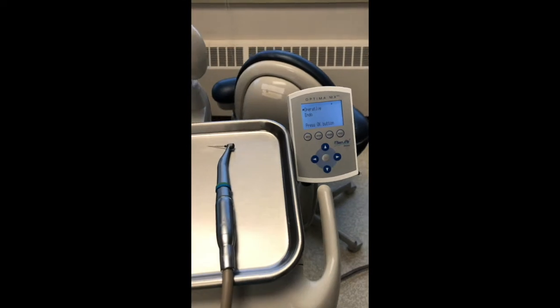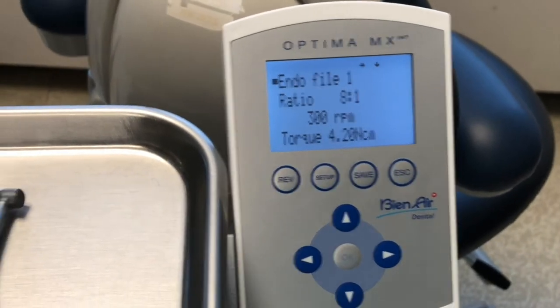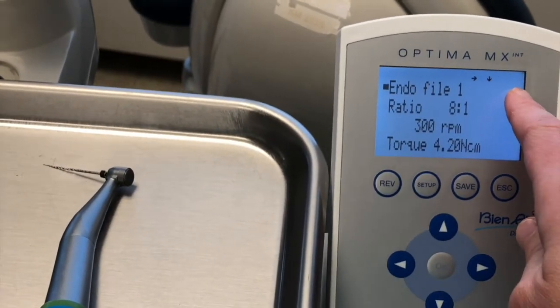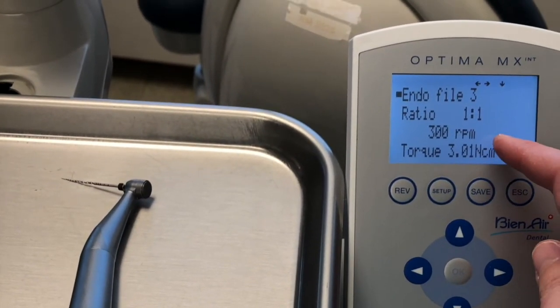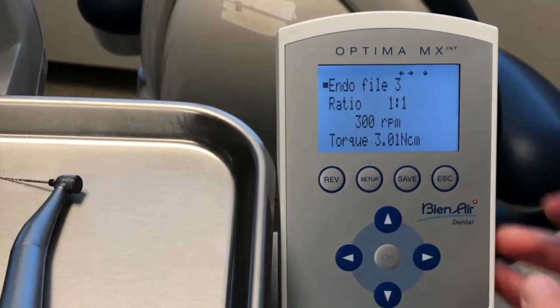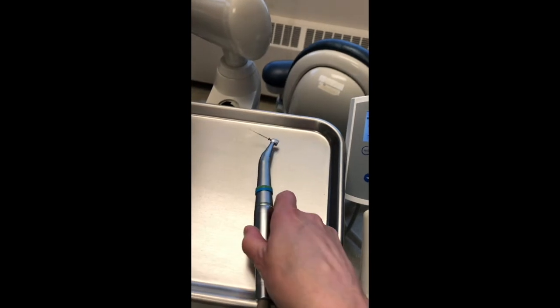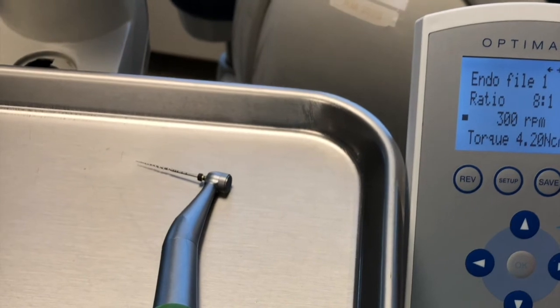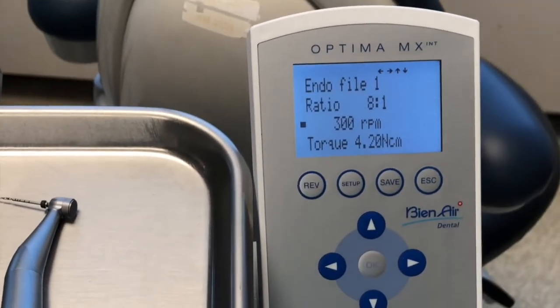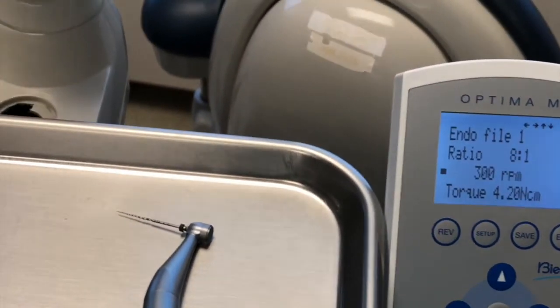Right now this was already preset: endo file one. If I was using a multi system with different torque or RPM recommendations, you could set those as well. The ratio is 8-to-1 and you want to confirm that's what your handpiece is set at. For Pro Taper Next, 300 RPMs is sufficient — 300 to 320 — and the torque can be anywhere between 3 and 4.2 Newton centimeters. This one is already set up and ready to go.